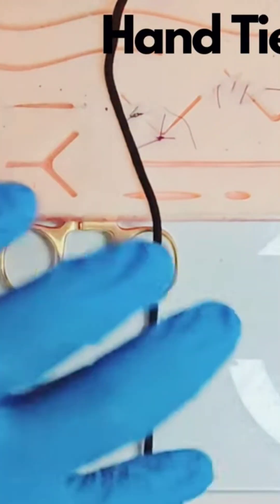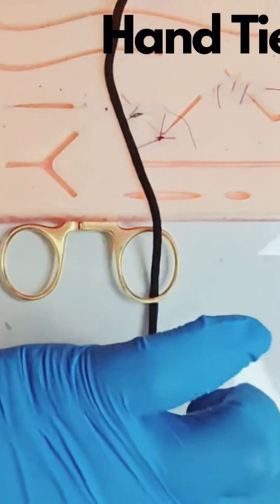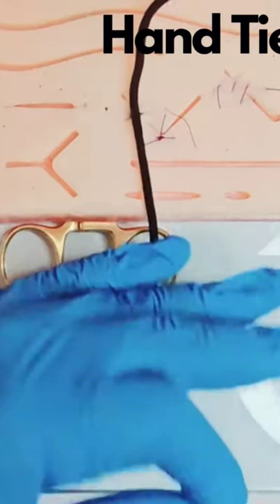Use your left hand to pinch the short thread between index and thumb, supinate your hand, making the thread run up your palm.